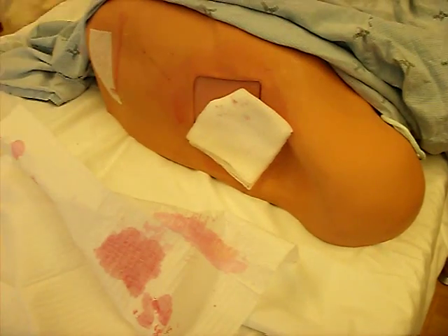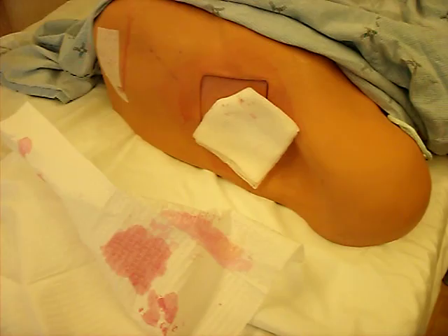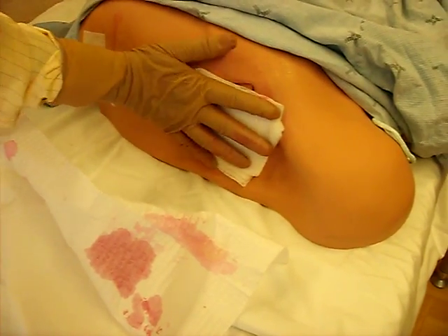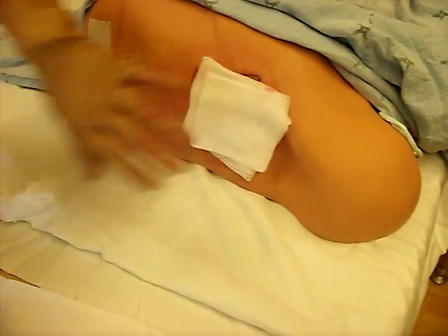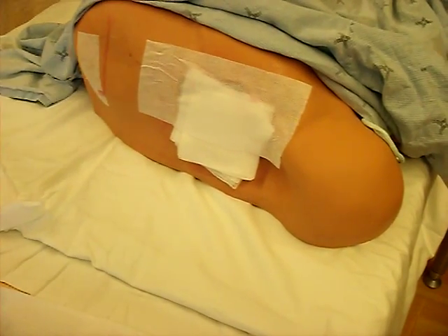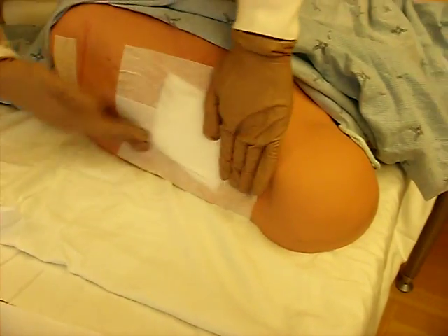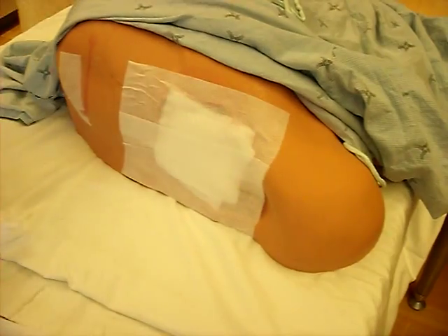That's generally the procedure. Once you've got the gauze and all of the Vaseline dressing on top, you're going to bulk up that dressing because there still may be some drainage from it. I suggest a few ABD pads if you feel it's going to be effluent. Otherwise, a few good chunks of gauze and some Hypafix to keep it in place. Make sure that it's not sticking to the armpit hair. That's often one of the most horrible things, is getting it so close to the armpit that the patient's in discomfort.